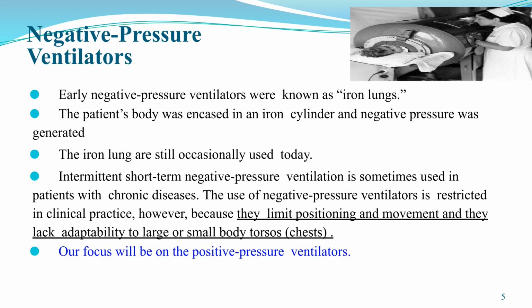Early negative pressure ventilators, like the iron lung, encase the patient's body to generate negative pressure. Their use is limited today due to restrictions on positioning and movement. Our focus, however, will be on positive pressure ventilators.